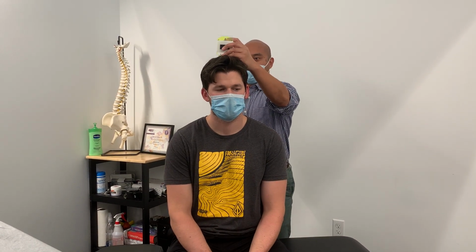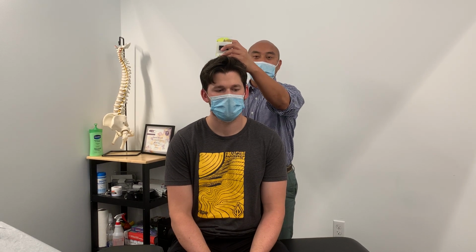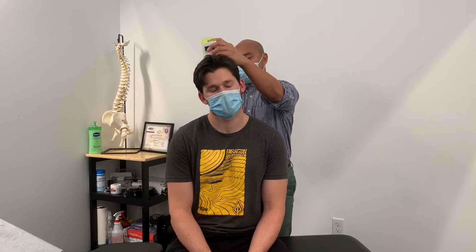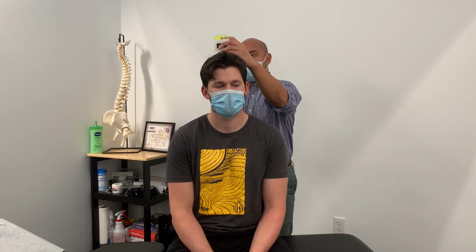With lateral flexion, I'll place the inclinometer on the top of the head, and again at T1, this time with the inclinometers facing me, and I'll actually be behind the patient this time. And he'll go ahead and touch his right ear to his right shoulder. Again, I'll note the range of motion for cervical flexion to the right.